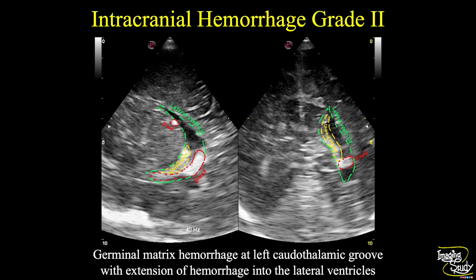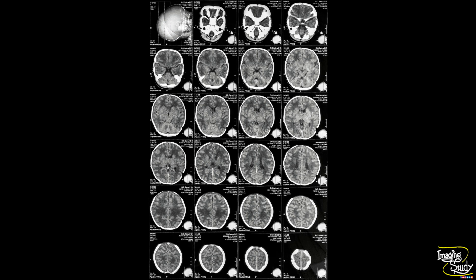We also did a CT in this patient. On CT, you can see diffuse hypodensity within the brain parenchyma due to hypoxic ischemic encephalopathy, but the hemorrhages are not seen well. This demonstrates the superiority of ultrasound in neonates — you can easily detect grade 2 hemorrhage, which is very difficult to locate on CT scan, a modality that is more superior for assessing brain hemorrhage in adults.